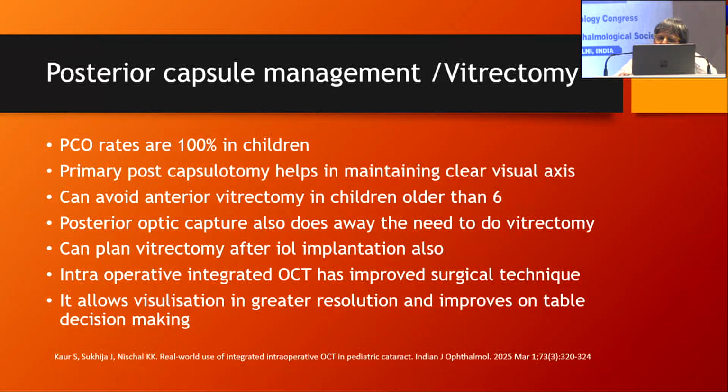Posterior optic capture also does away with the need to do vitrectomy, and there is enough evidence to show that it can help you avoid vitrectomy, and you can just get away with PPC and have a good clear visual axis months or years later after surgery. You can do a vitrectomy after IOL implantation also.